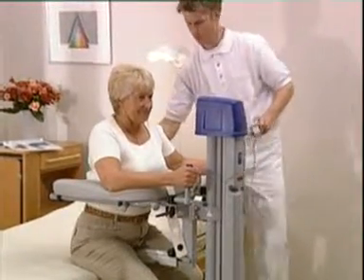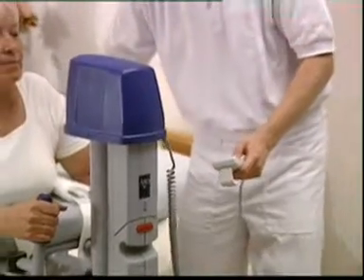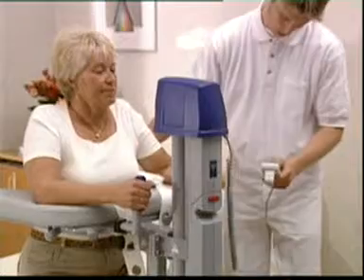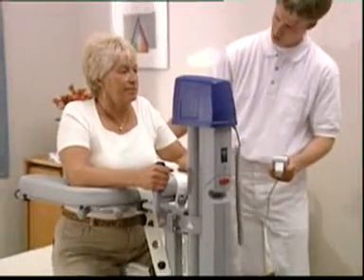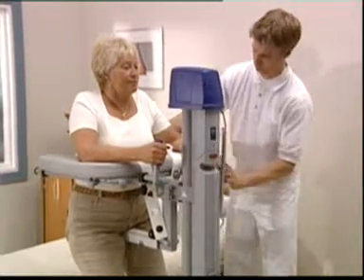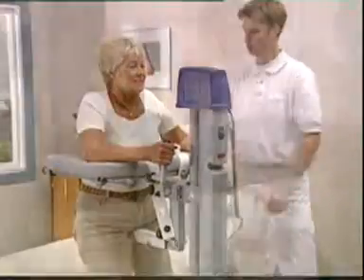The handset allows the therapist to stay reassuringly close to the patient. Its high-low function eliminates the dangers of manual handling. Transfers are safe for patient and therapist when raising or lowering to and from a standing position.